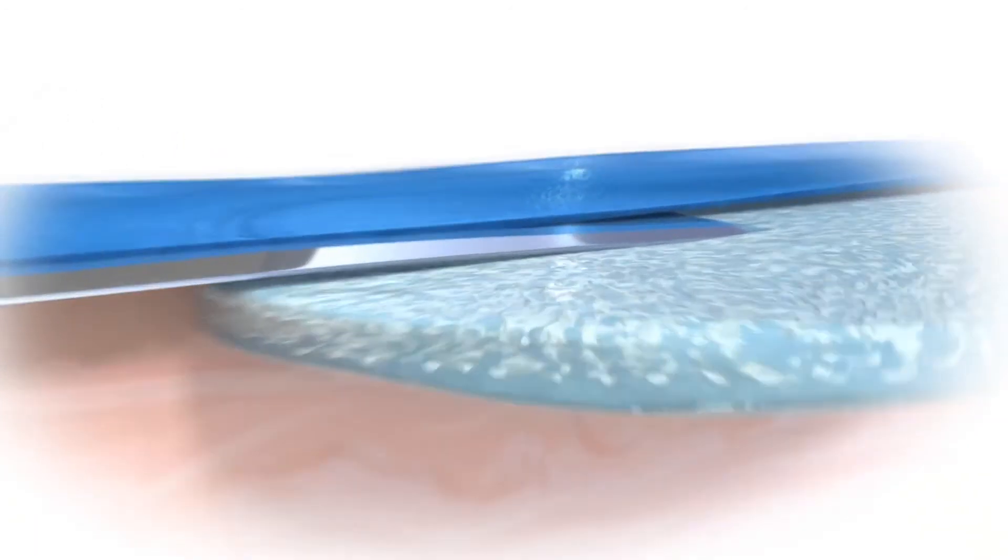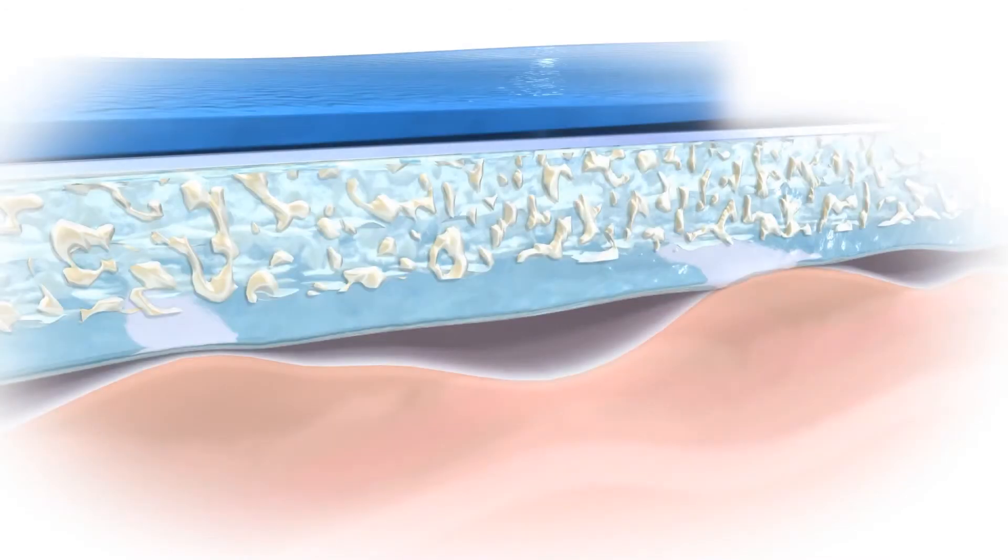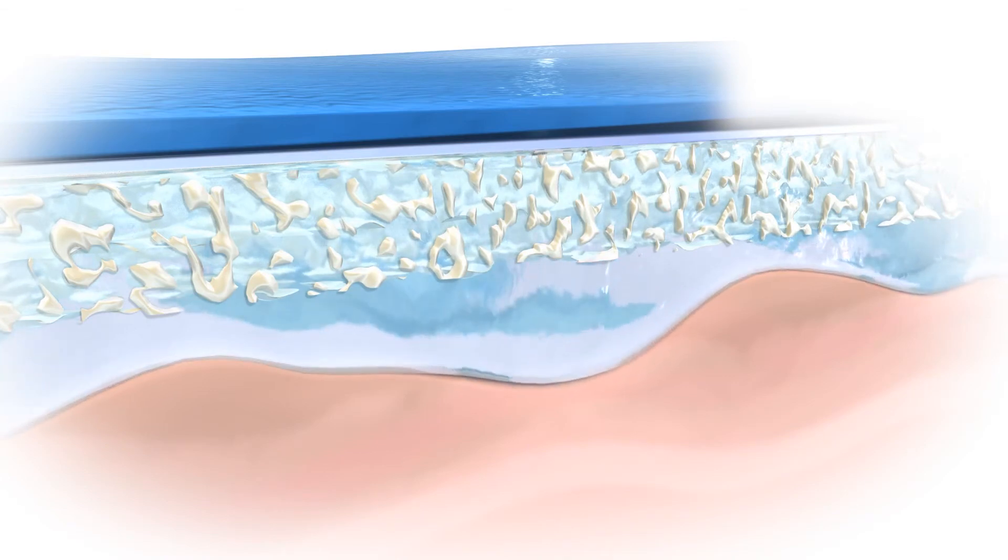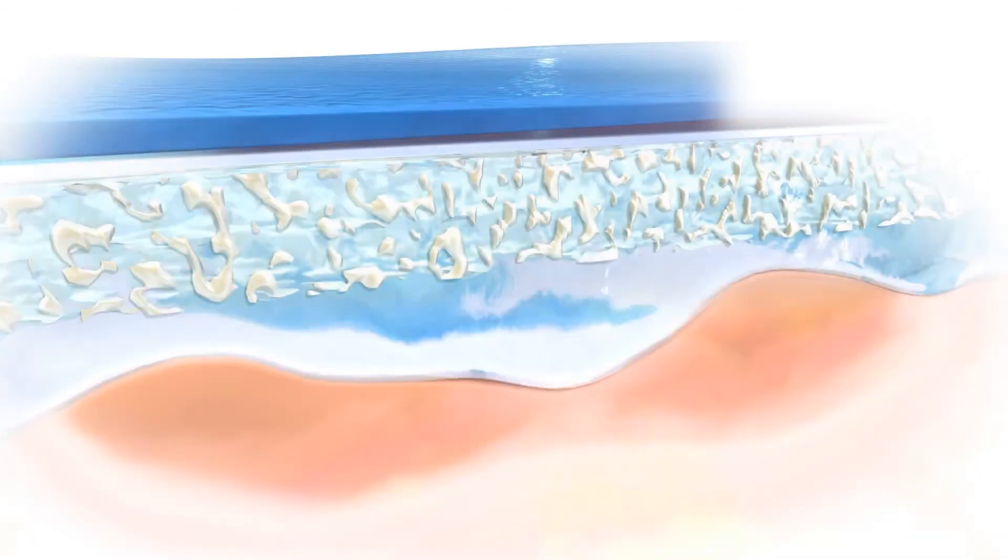Skin impedance is the resistance to conduction of electrical current through the skin. The gel on the underside of the electrode reduces the skin impedance by establishing a close contact between skin and electrode.